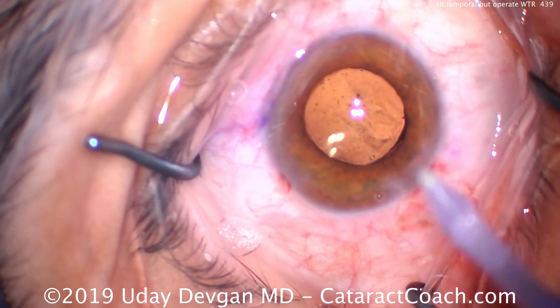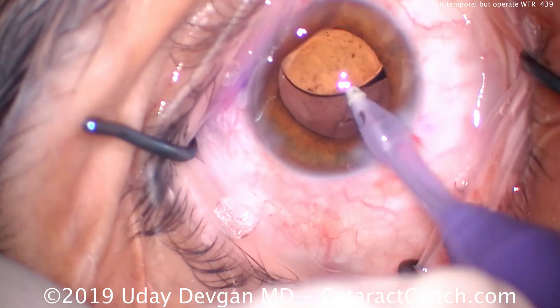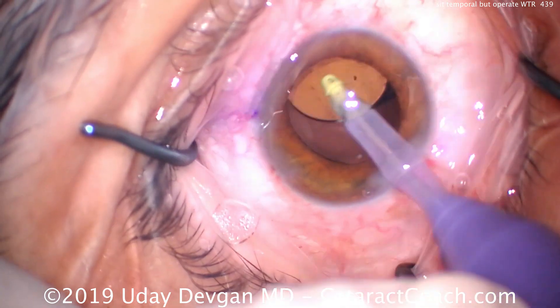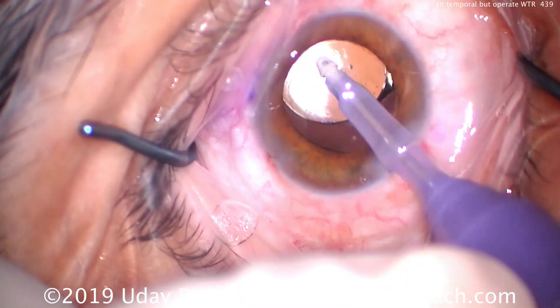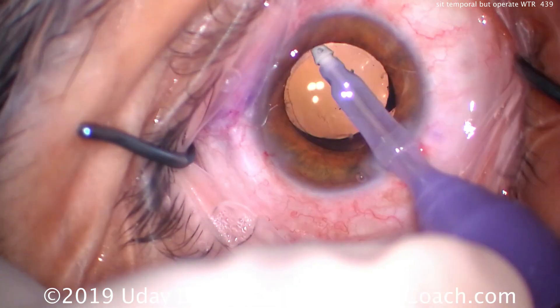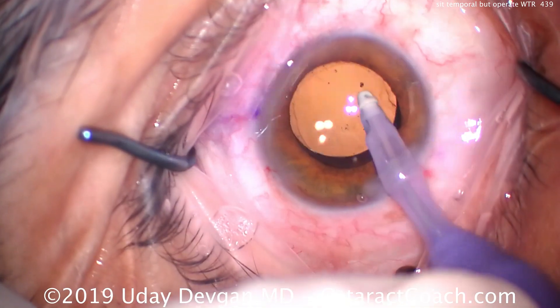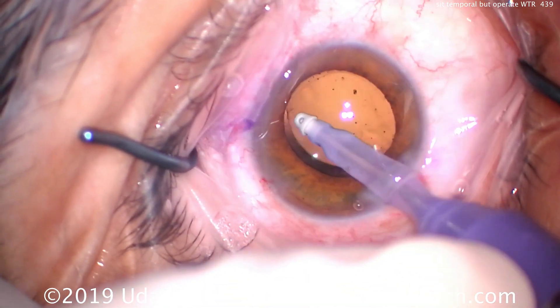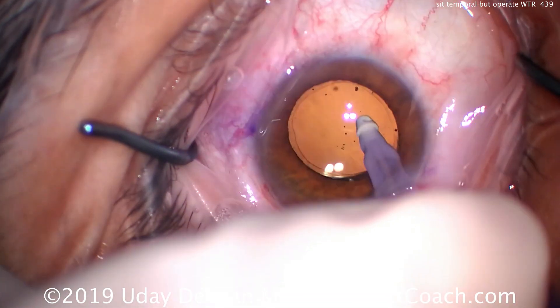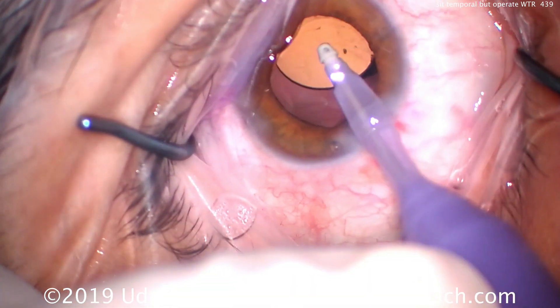We'll get the lens into good position. Now, could I have sat superiorly as well? For sure — you can sit superiorly and make your incision at this 75 degree meridian. But here I wanted to show you that if you prefer sitting temporally — perhaps the patient has a very prominent brow or deep-set eyes and it's easier to access the eye temporally — you can still make your incision at a with-the-rule orientation, at or close to the 90 degree mark, in our case about 75 degrees.